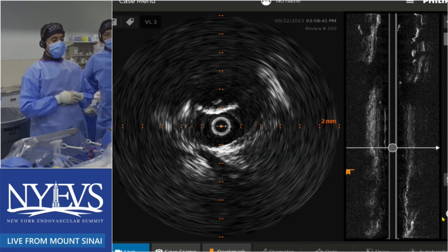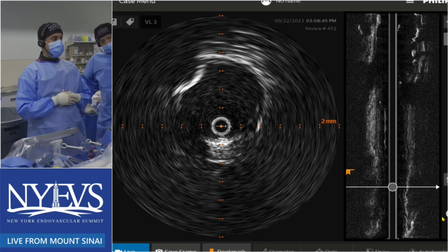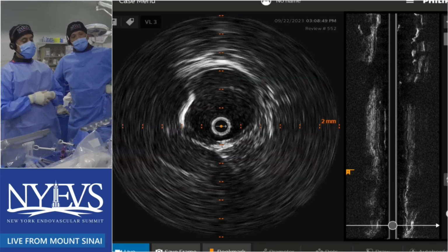You want to call it recoil, or the shockwave didn't work, or we didn't need a shockwave to begin with? I don't know. Because the vessel reference size is around 8.0. So we used 1-to-1 actually. 1-to-1, yeah.